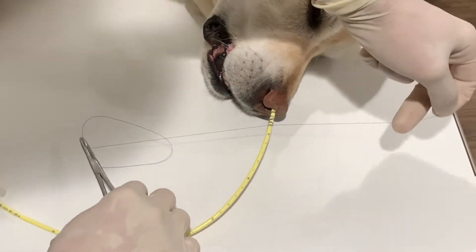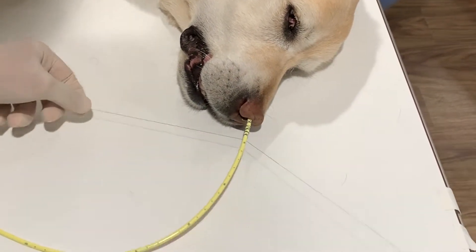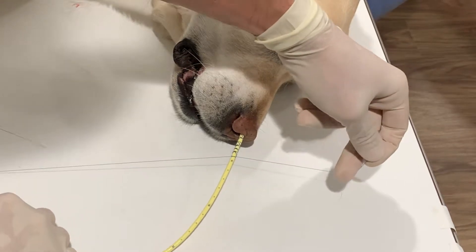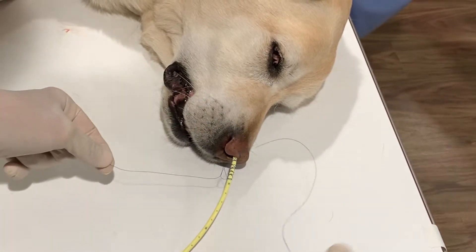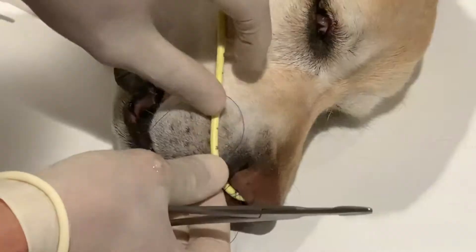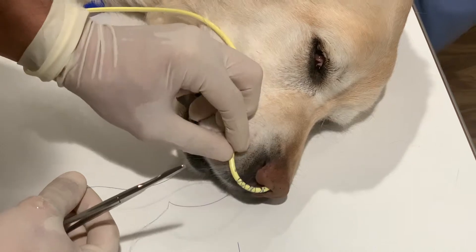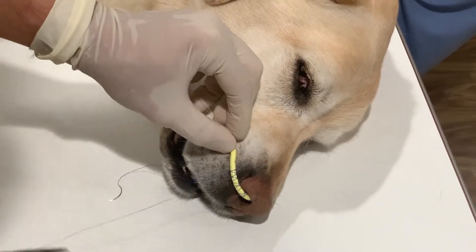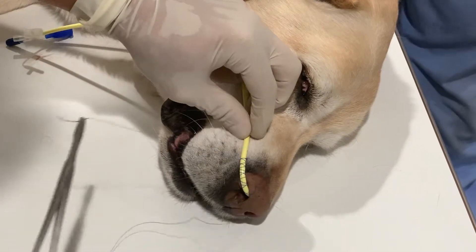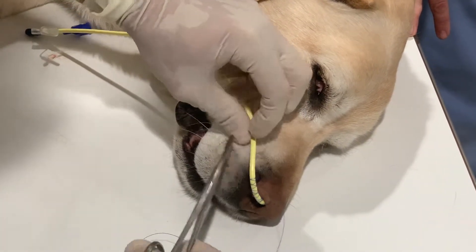Jackson is doing just fine. We're continuously monitoring oxygen levels, heart rate, and respiration rate, making sure he's doing okay with the sedation. The next step is to anchor the feeding tube to the side of the muzzle. You don't want to be too tight or else it's going to be uncomfortable, but you don't want it too loose or else they can get the feeding tube caught on stuff — so you want it just resting on the side of the muzzle. We'll put another anchoring suture on the side of the muzzle, and again you want to be pretty aggressive because they have thick skin there and pets are going to want to pull the feeding tube out.